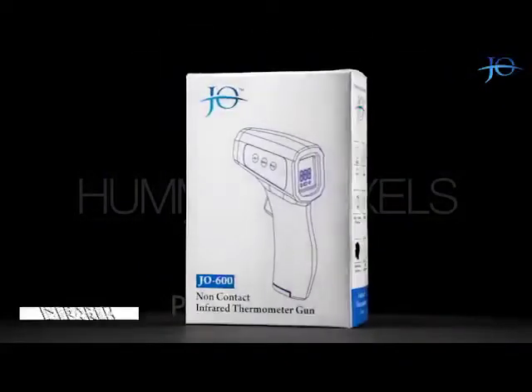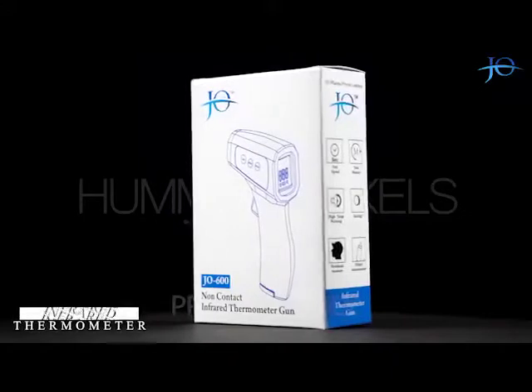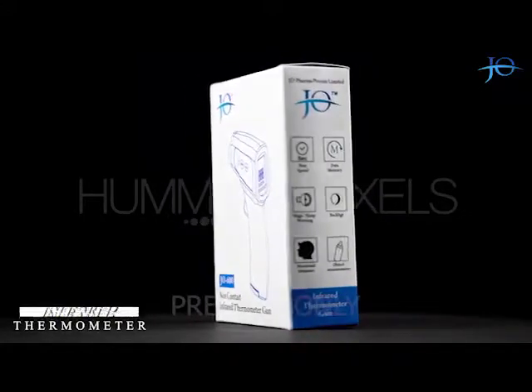Hello everyone! Today we are going to talk about a non-contact infrared thermometer gun by JO Pharma Pvt Ltd. So let's get started.